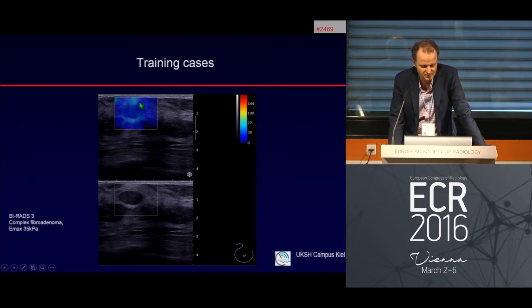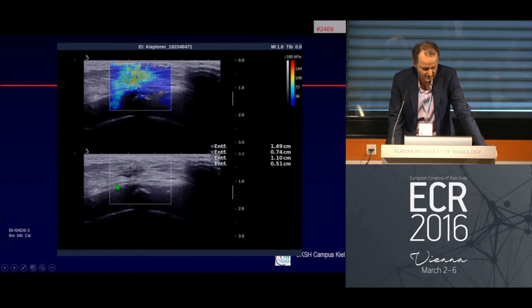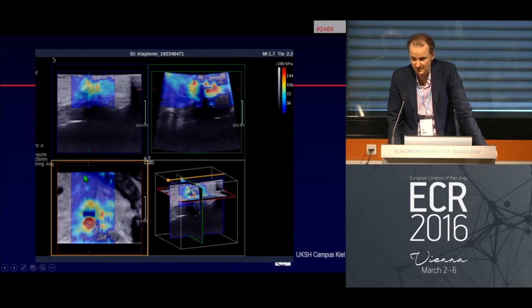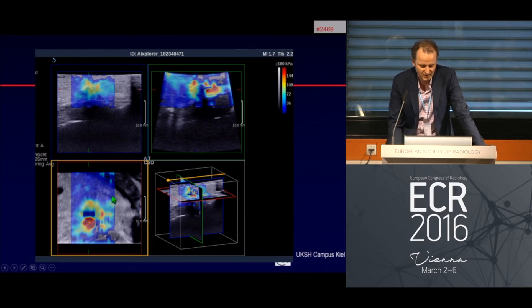Complex fibroadenomas explain the turquoise colors around the lesion, whereas normal myxoid fibroadenomas are very homogeneously blue. Another case: a hypoechoic, not well-defined lesion corresponding with turquoise-orange color — this is invasive lobular cancer. We can also perform 3D imaging, and with the recently acquired 3D probe it is impressive how lesions can be described in all planes. This large cancer is clearly visible and highly suspicious in any plane.